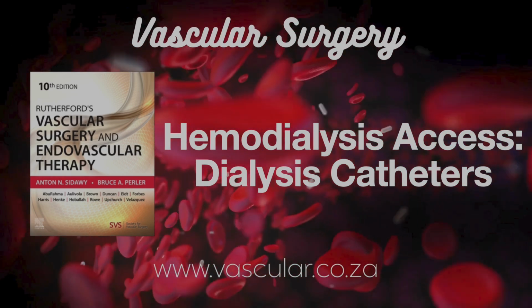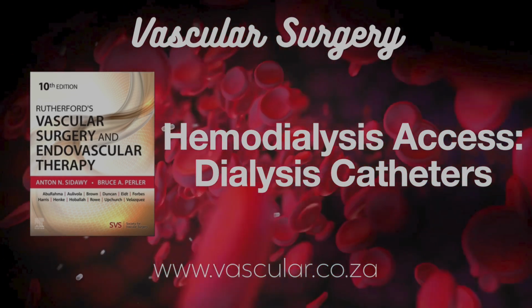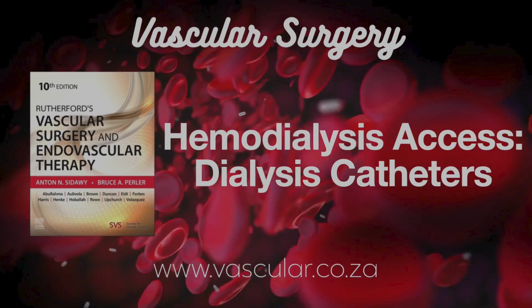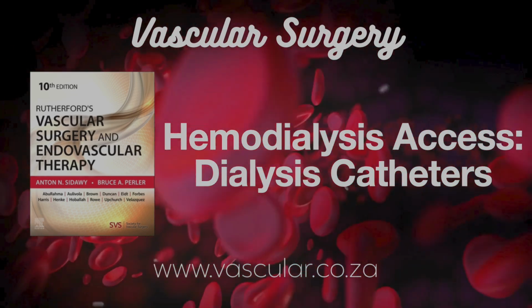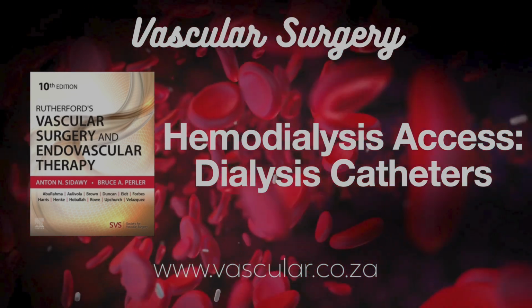Wire embolism. Losing the guide wire inside the patient sounds bad. It can be. It can happen if you lose grip or if the needle shears off part of the wire, especially those thin micropuncture wires if you pull back hard against the metal needle. What do you do? If you feel resistance pulling the wire out, stop. Use fluoro. Maybe pull needle and wire out together. If a piece breaks off, it usually needs retrieval with a snare device in the angio suite.